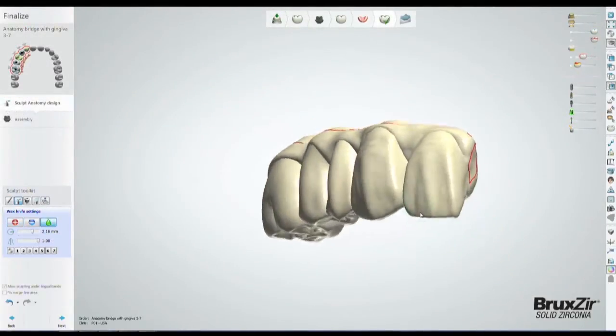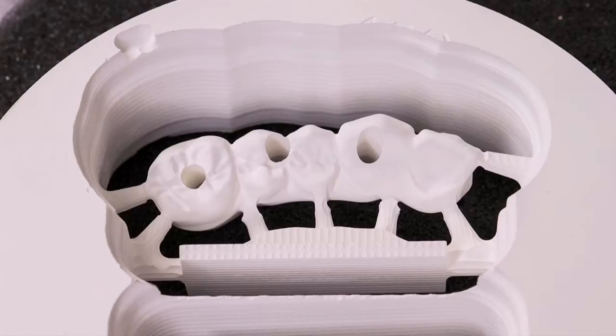After the prosthesis design is ready for manufacture, it is milled from a block of Bruxer Solid Zirconia.